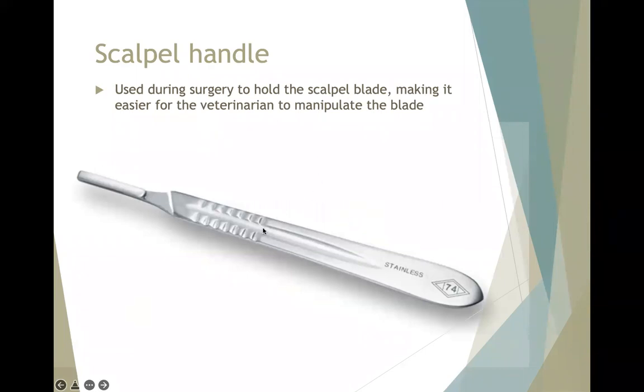Now, these handles, as shown previously in that chapter 9 lecture, they can look different. They can be shorter or bulkier in nature, or longer and thinner. It's going to depend on that surgeon and what's comfortable in their hands. If you have somebody that is 6'6" with very large hands versus somebody that is 5'2" with way more petite hands, you may use different scalpel handles between those two surgeons, and they're going to have their preference on what they would like to use.